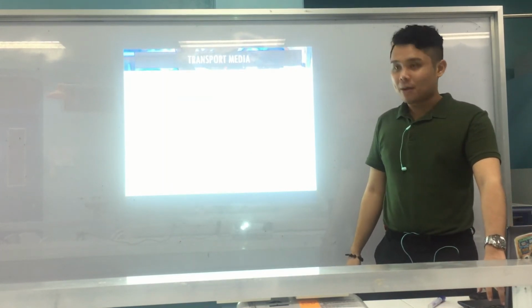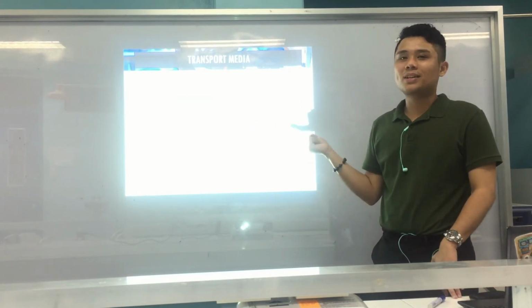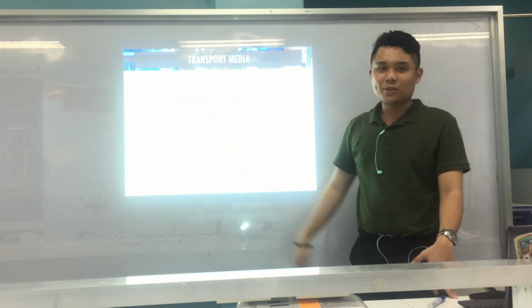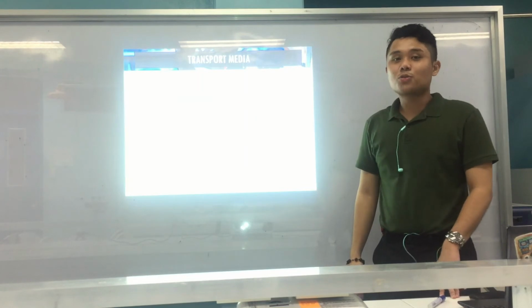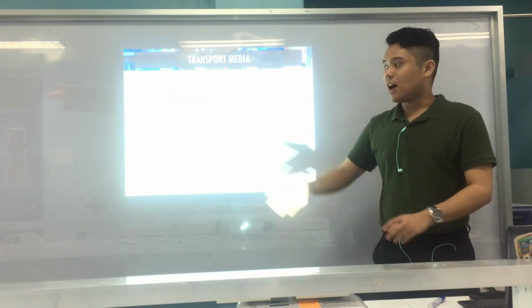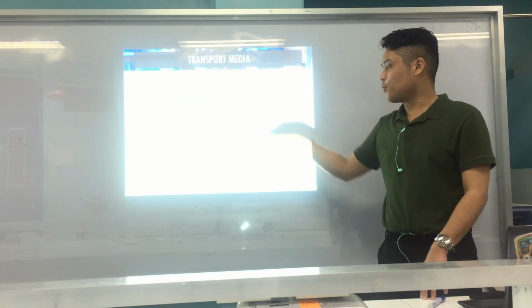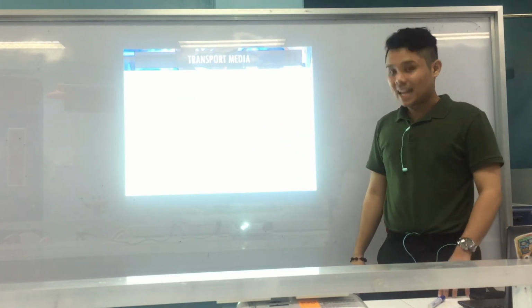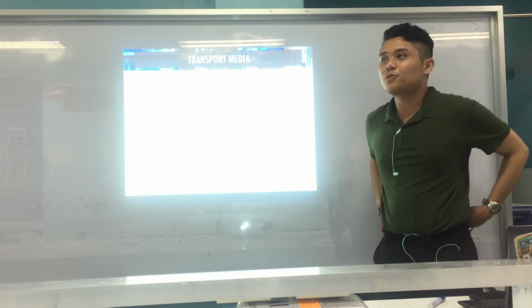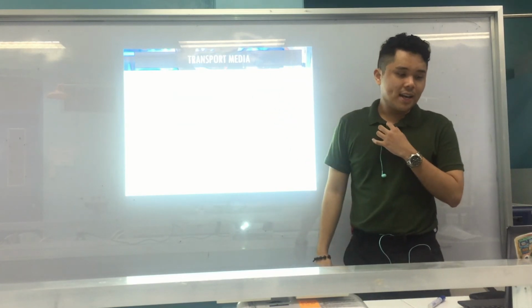You could also use alkaline peptone water. Alkaline peptone water is for Vibrio cholerae. Now, I'm not sure if it can be used for transport, but I think it could also be used for transport. But alkaline peptone water is also used for enrichment. Okay? So it's an enrichment broth, to increase the numbers of your Vibrio cholerae. Okay. And 1:1 glycerol and 0.033 molar phosphate buffer is for Shigella species. You could also use Stewart's and Amies medium. All right. But most of the time, for stool specimens, the transport medium I encounter is Cary-Blair. Okay? Cary-Blair medium. All right.